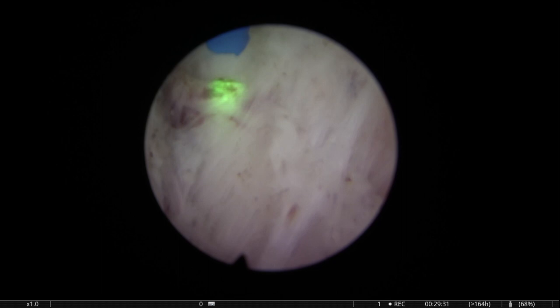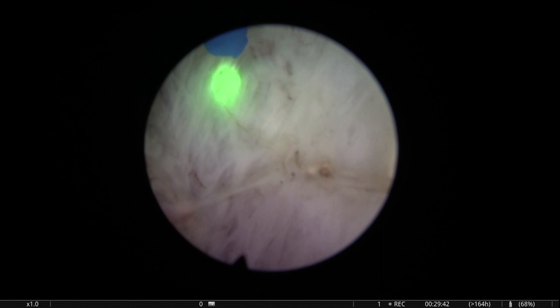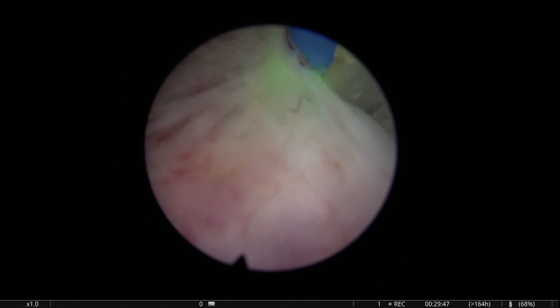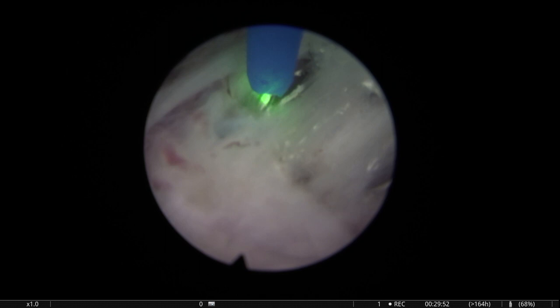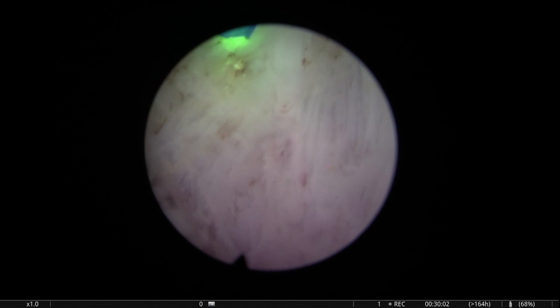Of course, excellent visibility helps a lot, not having blood all the time blocking your vision. And here it pays off to be careful and carry out good hemostasis with low power lasers. You often have to go back, stop the vessels that are bleeding, and in this way carry out a good hemostasis. So when you finish the enucleation phase, you can move on to morcellation relatively fast.